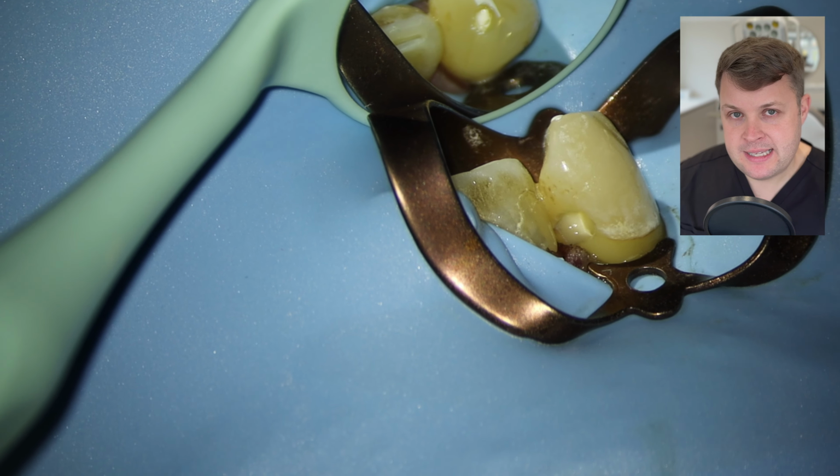We're then going to place our disinfected size 10K file, and I'm going to place this to about maybe 2 to 3 millimeters away from the working length. And what this does is it gets rid of any sort of air bubbles. It introduces the bioceramic all the way to the end of the tooth.